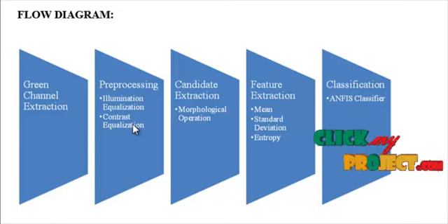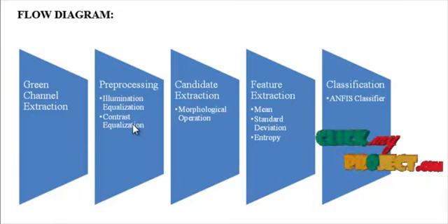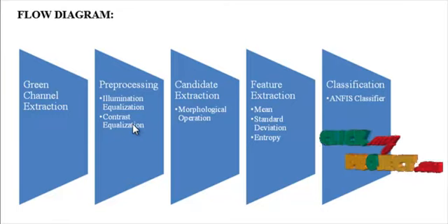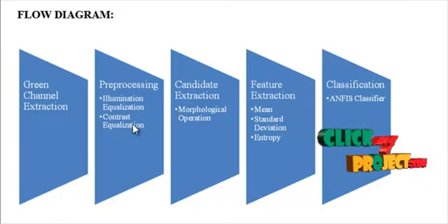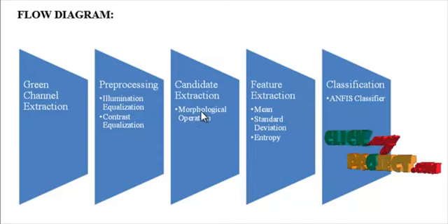In both of the process, the overall intensity of the retinal image is normalized and the regions were brightened so that we can identify the defected portions more effectively. Then we move on to the candidate extraction process.